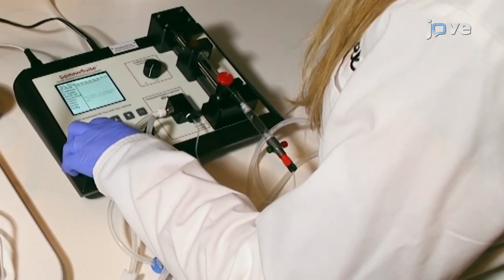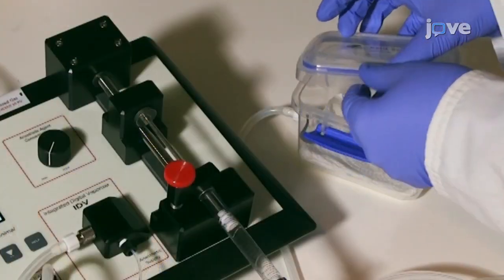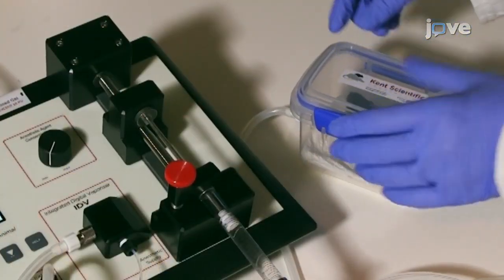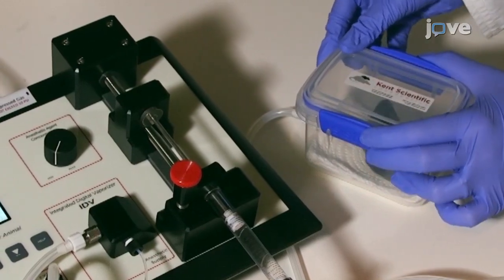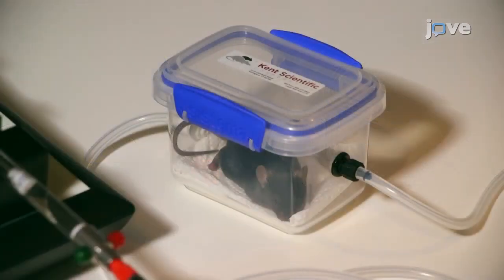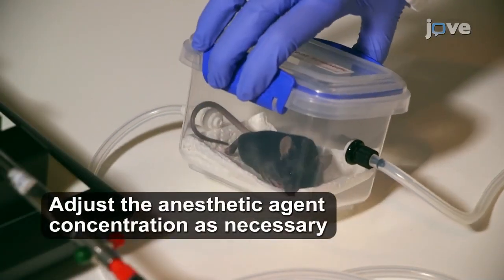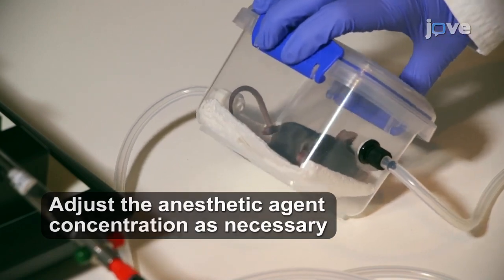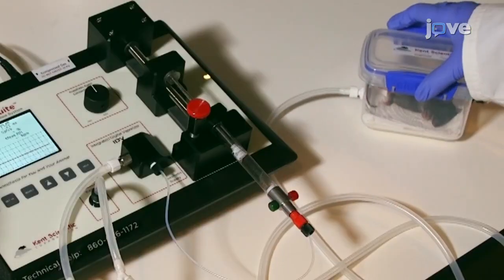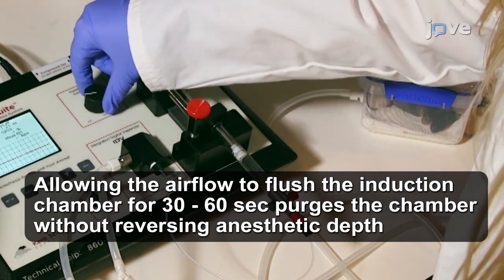Begin the airflow to induce anesthesia in the mouse. Place the mouse in the induction chamber, close the lid tightly, and adjust the anesthetic agent concentration dial to deliver 3%. Monitor the mouse until it reaches the desired plane of anesthesia determined by loss of the righting reflex. Once the animal is sufficiently anesthetized, turn the anesthetic agent concentration dial to deliver 0%.